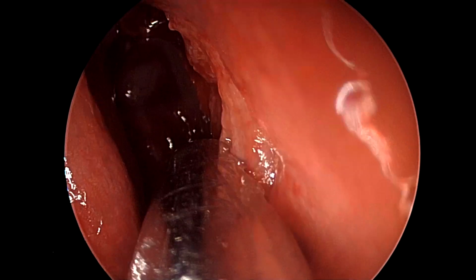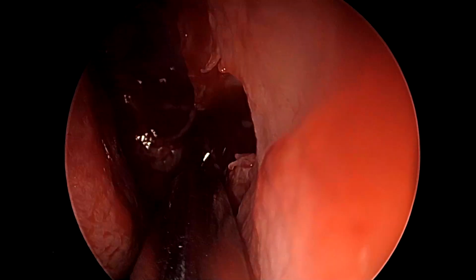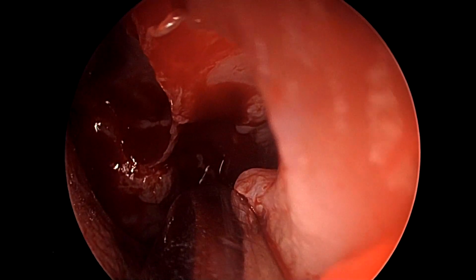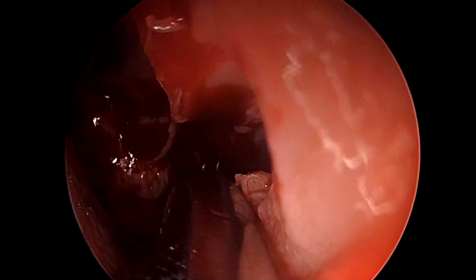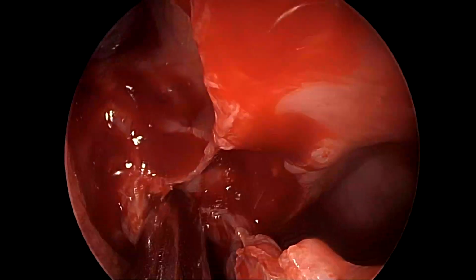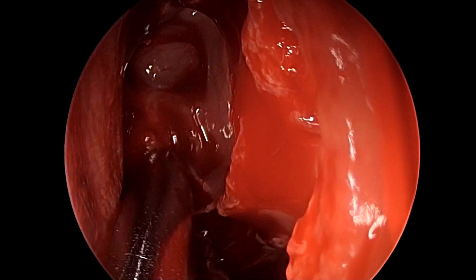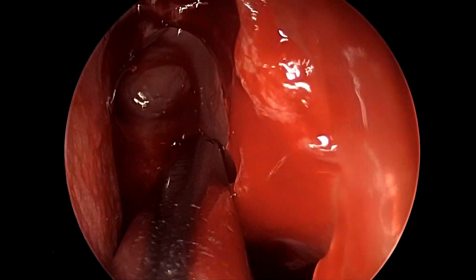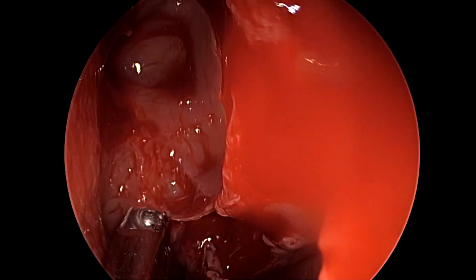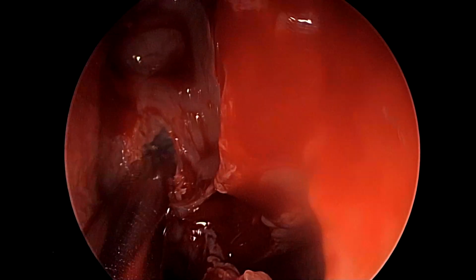So we are focusing here right now on creating a wide access to the surgical space, so as to give our graft material ample amount of bone to lie on, hence clearing of all the mucosa and excess mucosa fragments in the bone. Since the defect is very clearly in the fovea and is well visible, it does not seem required to open the sphenoid in this situation.